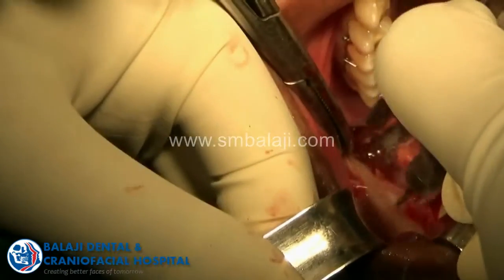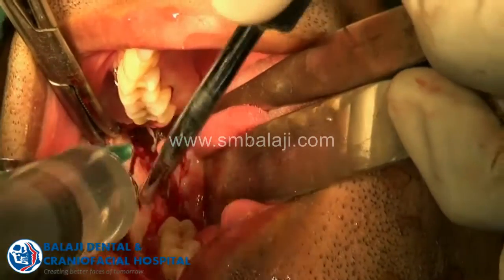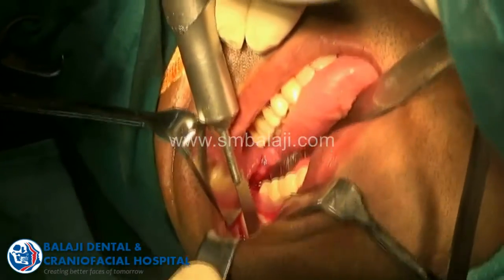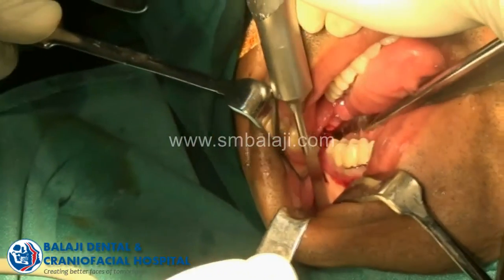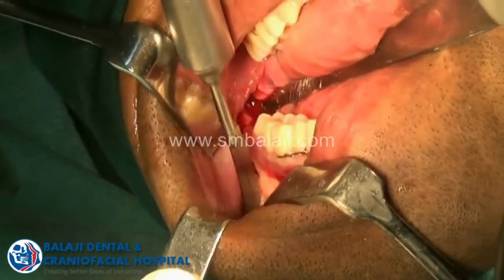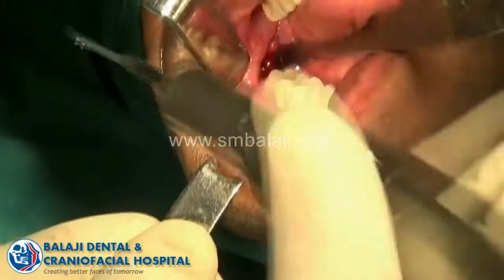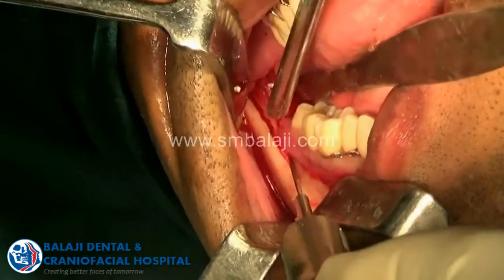I use a burr as well as the saw — I am quite comfortable with both. You can see me using a saw to make the vertical cut on the body of the mandible. The only thing is you should be very careful about the position of the nerve, and that feel comes only by experience — when you make the cut on the cortex as well as when you go inside.